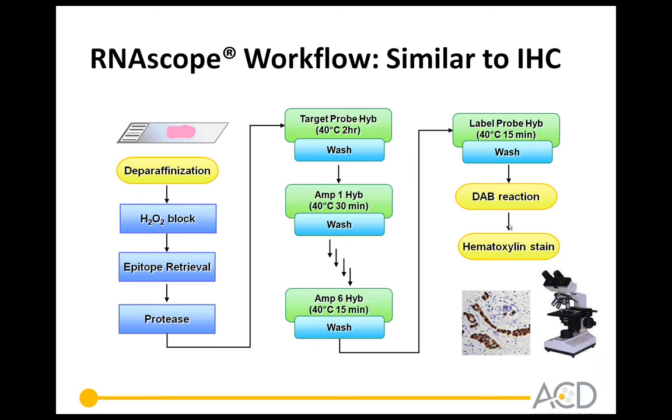And at the end of this, you would have an easy-to-visualize chromogenic slide stained for your RNA marker of interest that could be visualized with a simple bright field microscope or with any kind of a slide scanner. And the resulting image can then be analyzed with a tool such as the Spot Studio.